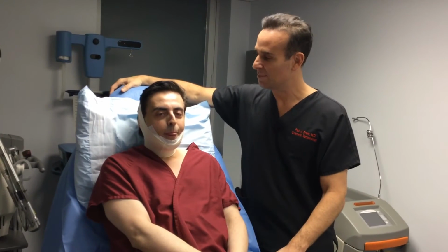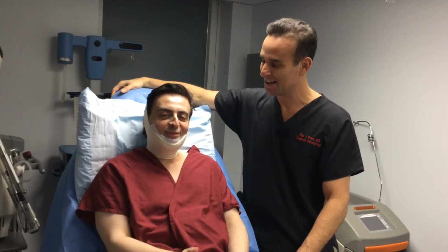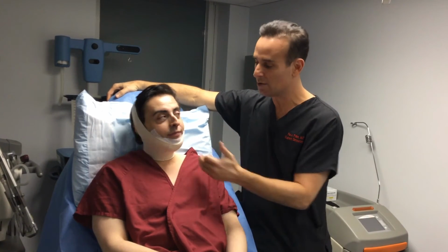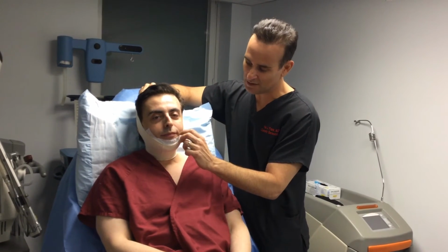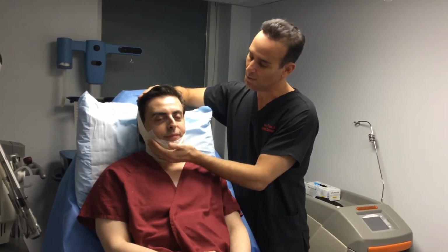Okay, so we're here in post-op. He did great. He's not crying or screaming or anything like that. He's still smiling. So we finished the procedure. I did the melting. A little bit of fat came out. We tightened the skin from underneath. This is just a bandage for 24 hours. We put some bandages under here, a little Neosporin on the two teeny holes. There are no stitches. And we put a little pressure.